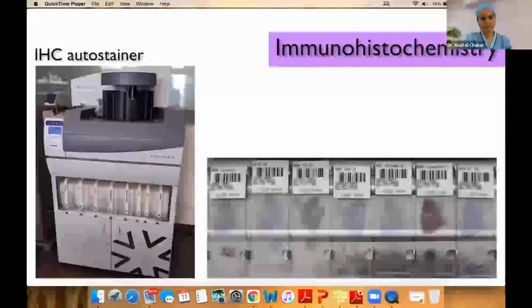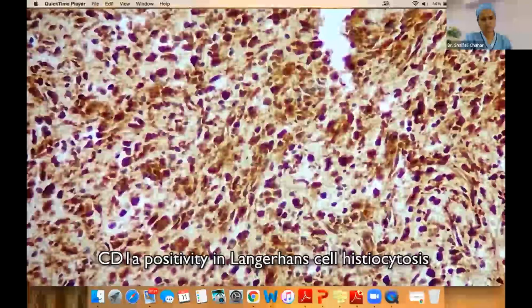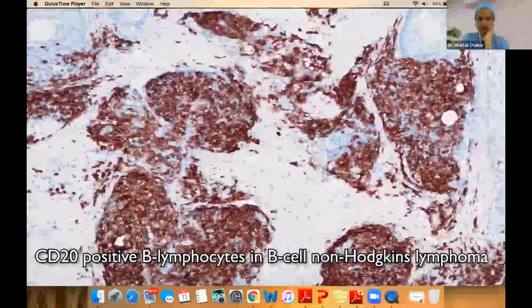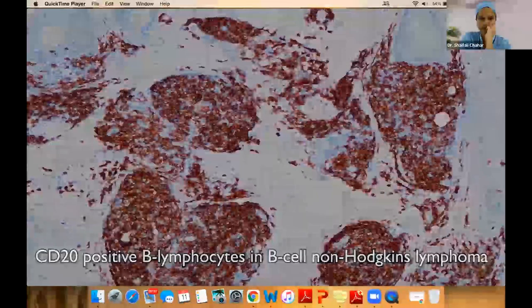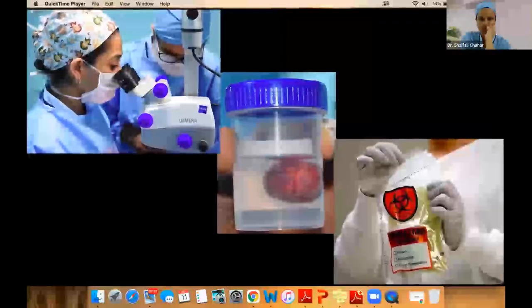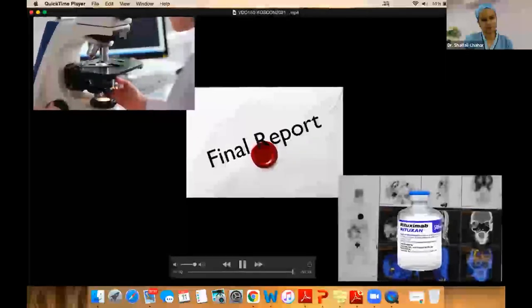Immunohistochemistry is a powerful laboratory technique that involves staining tissues with antibodies directed at a specific antigen expressed in certain types of cells. Aside from its utilization in diagnosis, immunohistochemical staining has increasing applications as a prognostic marker and guide for therapy. Conventional histopathology is rapidly shifting towards digitalization. The partnership of ocular oncology and pathology allows for the seamless integration of diagnostic services, therapeutics, and clinical research, thus providing patients with optimal comprehensive care.